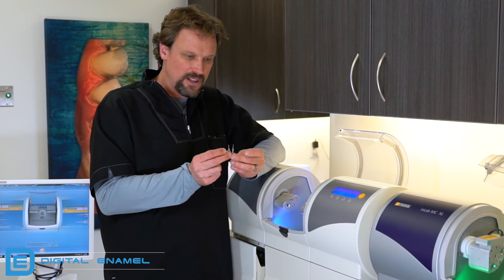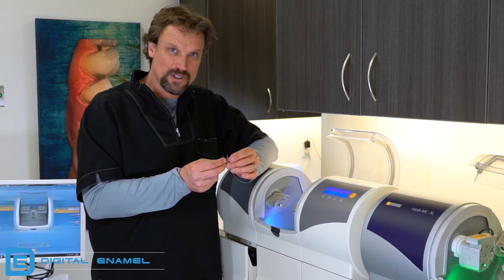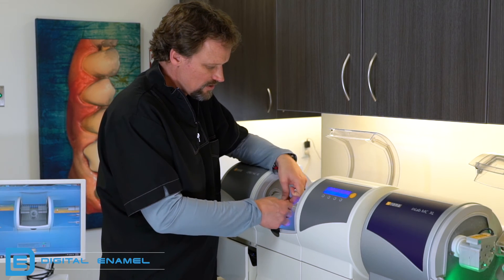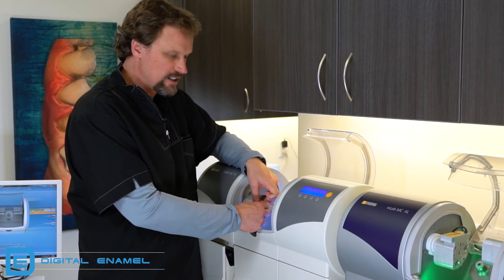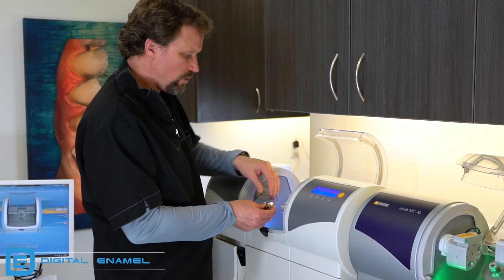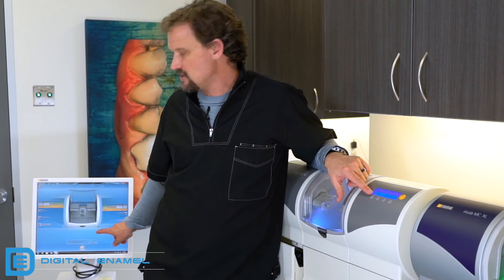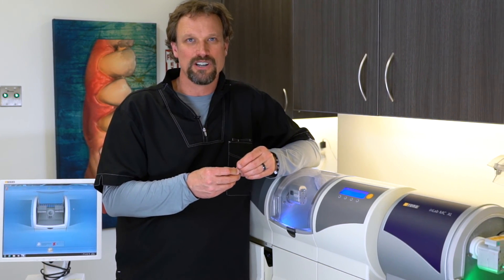Now put your burrs back in — look at them carefully to know which is which. The flat-ended burr goes on the left side; the pointed burr goes on the right side. If you don't know which is which, the box will have a little graphic. Turn the flat-end step burr in tight with your hands, then take the torque wrench and torque it all the way. The right side gets the pointed-cylinder burr. Tighten that up until you hear it crank, close the door, and then hit start on the milling chamber. You have just calibrated your MCXL.